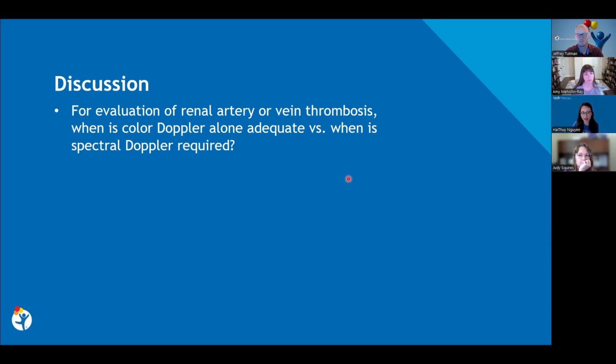Have you ever been asked to use ultrasound to differentiate? I'm guessing you would be able to, because when you put Doppler on it, there's no abnormality if there's no thrombus. But what if the thrombus is smaller, something you wouldn't be able to detect? Especially if on CT you don't see the thrombus, then what are the chances of it showing up on ultrasound?